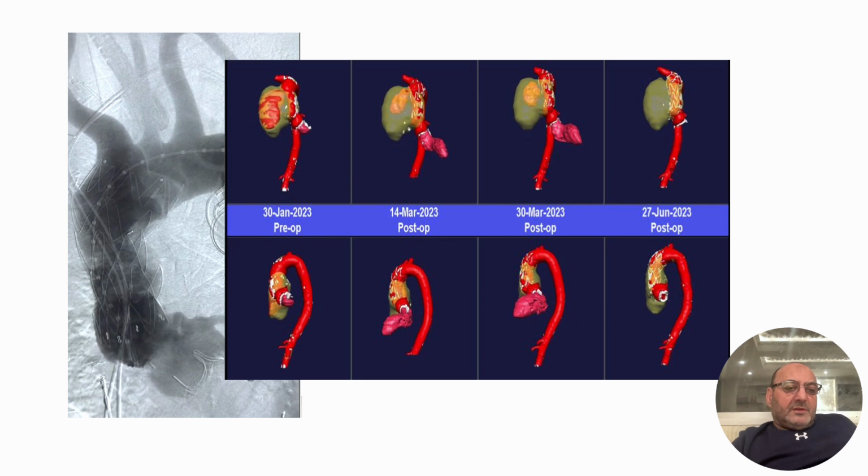So it's very, very important, again, to have the right team, the right skill. A small mistake can kill the patient in this case. While technically maybe it's not very hard, it is hard to do everything right and deploy it in the precise fashion. But I'm trying to tell you here that these stents and these procedures can be potentially life-saving, especially now that we're doing these procedures in an experimental fashion, only in patients who cannot have other procedures, open procedures, done.